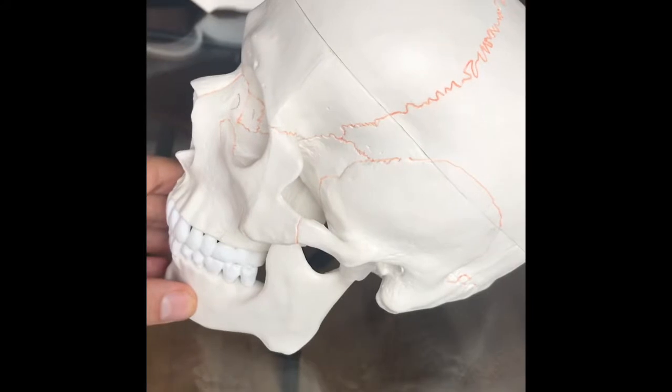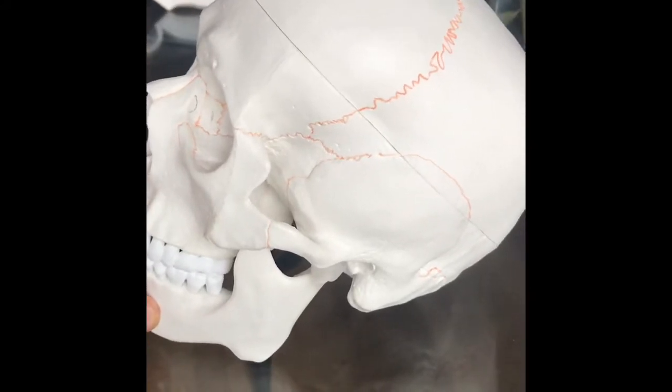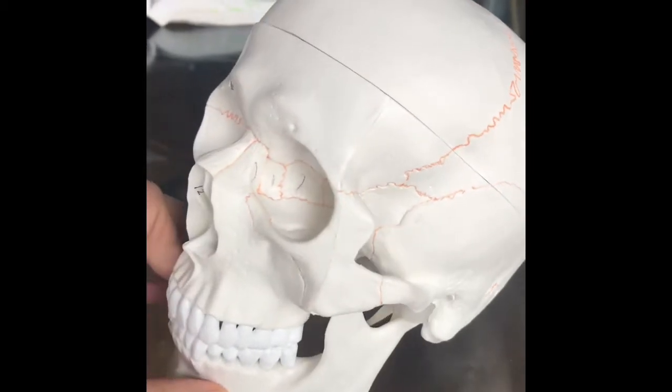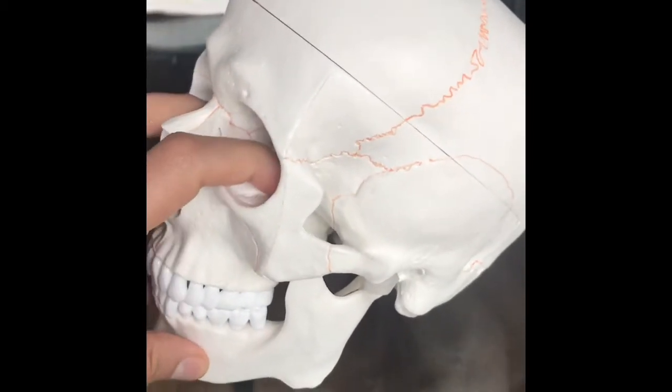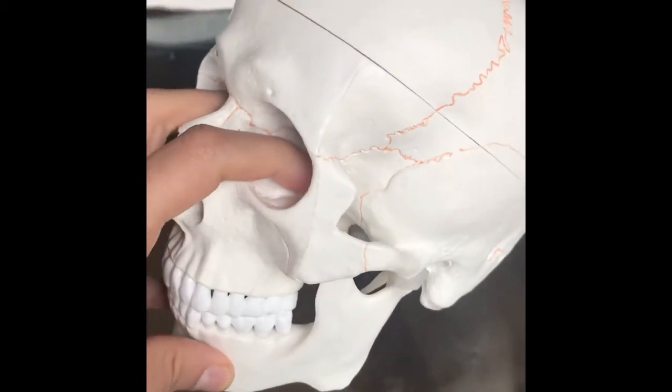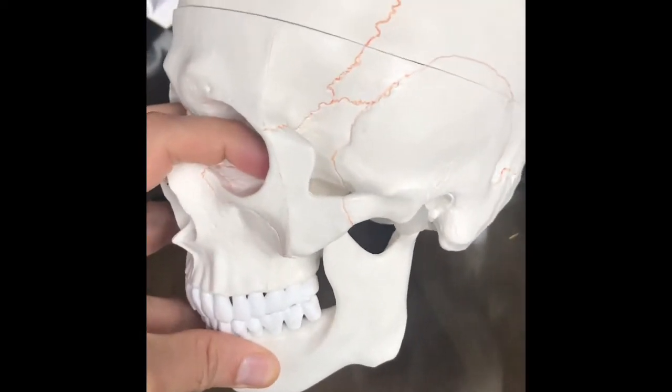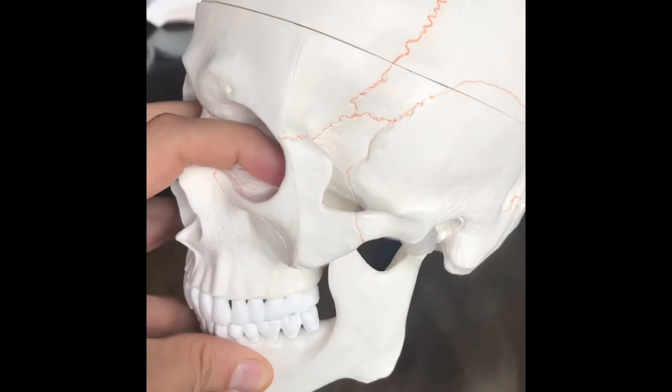So, just to reiterate, we are doing this exam based on a mesocephalic skull. And so you should always be able to cater to your patient based on their skull type. Just use the positioning lines that you know and learned to cater to your exam.